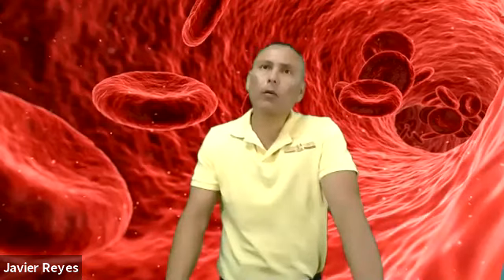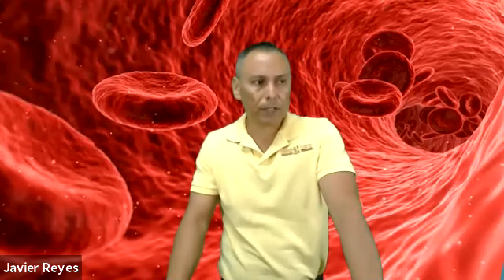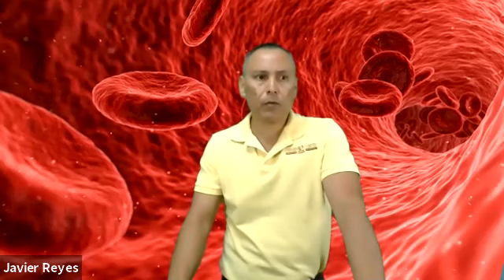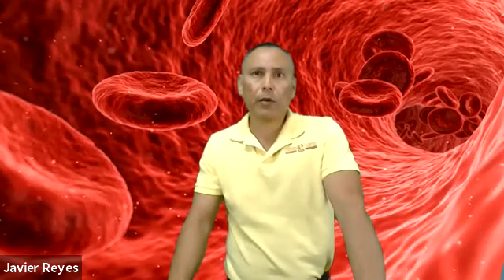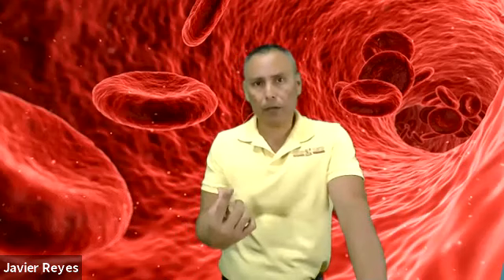Sometimes your blood flow will stop. It will come to a complete stop. Okay, why? Because the vein collapses. When do they collapse? Remember that you're going to select the equipment necessary depending on the condition of the vein and the patient. So if you have a weak, dehydrated patient, the veins are going to collapse because of the vacuum.